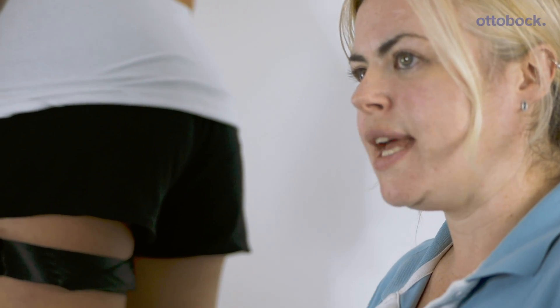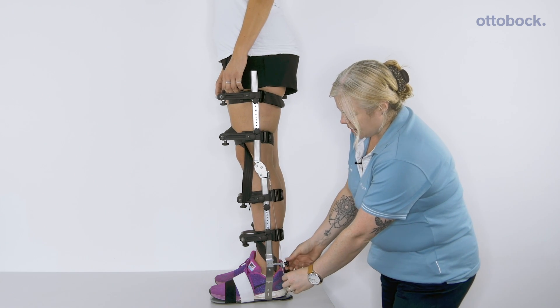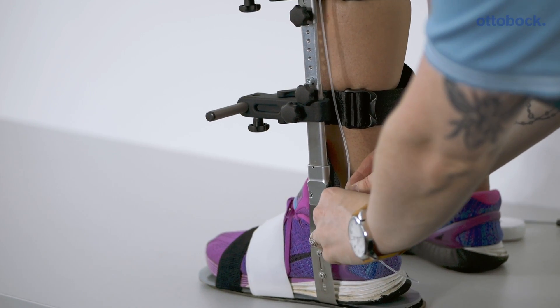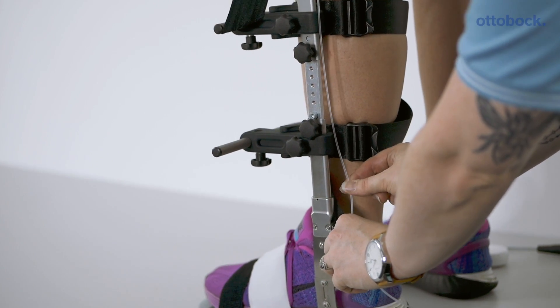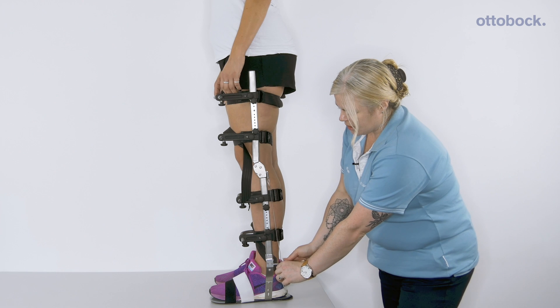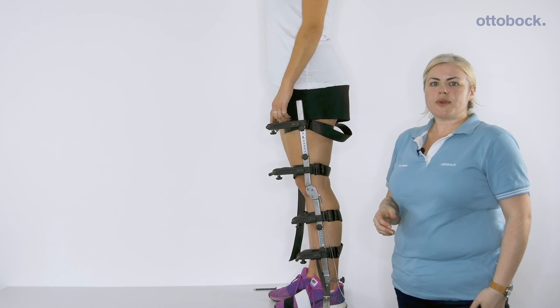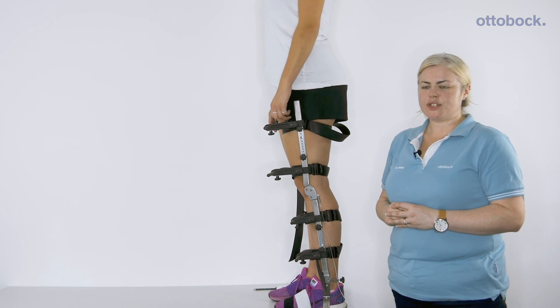Once the patient is standing safely we need to add tension to the unlocking cable. This is done simply with the patient standing by loosening the bottom screw and placing some tension on the joint. We don't want to unlock the joint, but just enough tension to give a bit of bounce, then tightening the screw back in. At terminal stance with hip and knee extension and ankle dorsiflexion, the cable will unlock and release the knee joint.